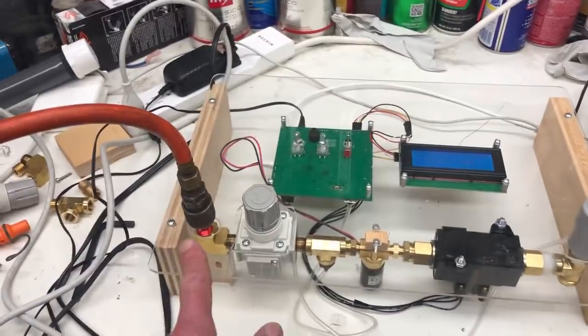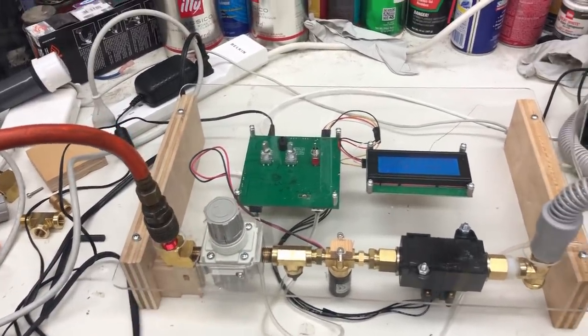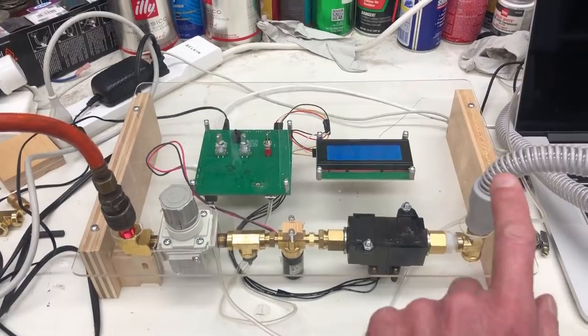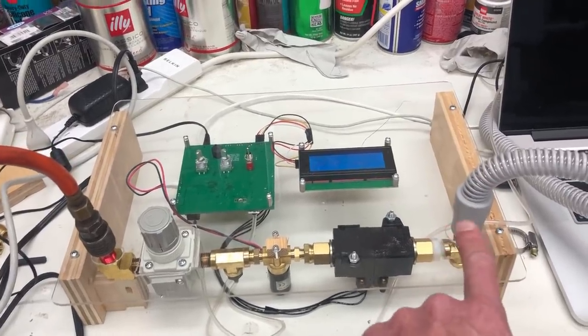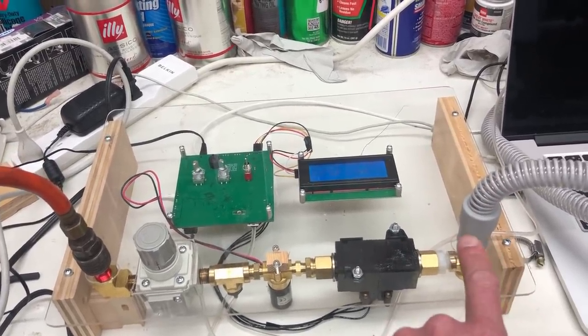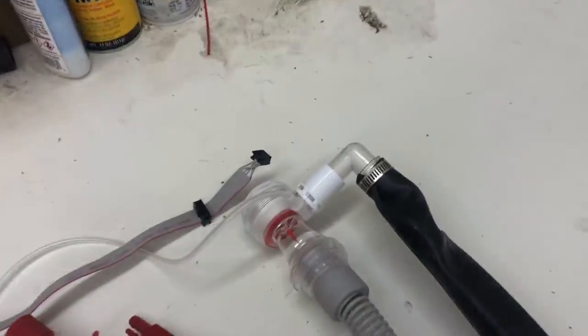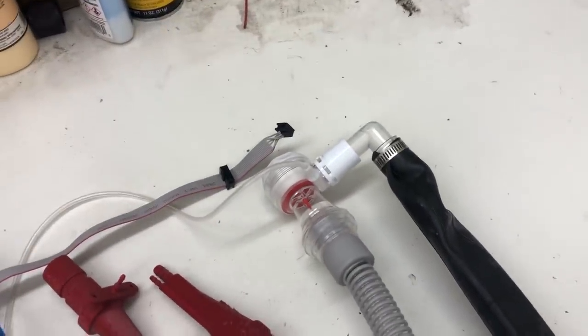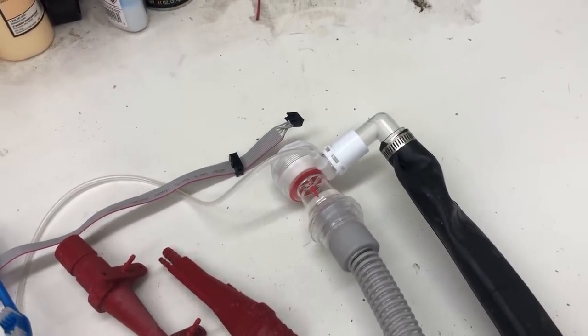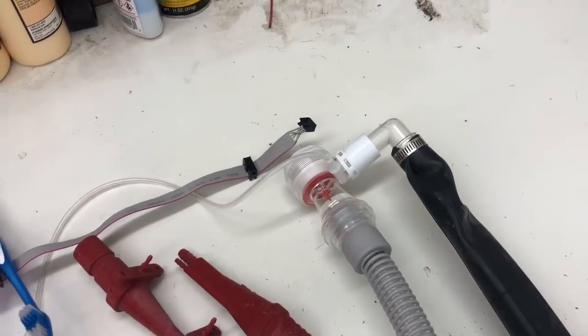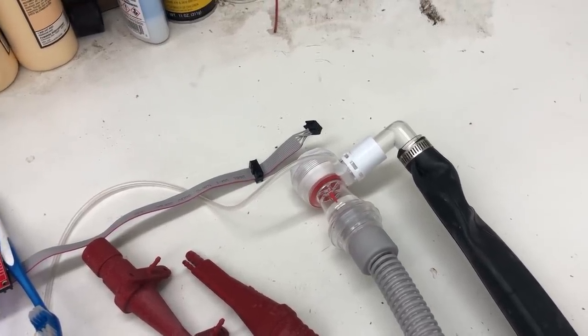And you could also have on the input a blend of air and oxygen if you need to provide an FiO2 higher than 21%. The output is precisely metered flow and pressure of air to a patient circuit, which is off of a standard ambu bag, a readily available medical device, and a PEEP valve can be put here to provide PEEP.